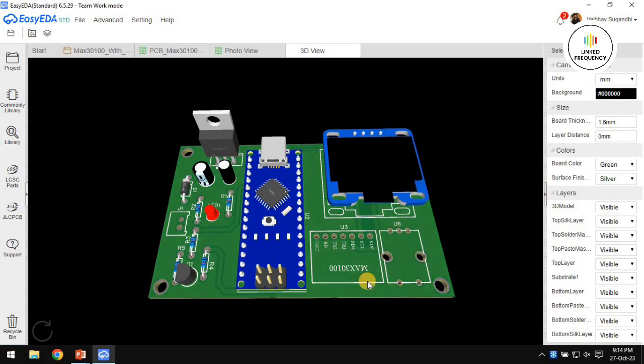We have to manage the placement of the components in such a way that the user should be able to place one finger of the left hand on this MAX sensor, and with the right hand use this rotary encoder to operate this screen as per the requirement. You have to think at a user interface or user experience level while you are designing the components or the PCB, which includes the user interface. That's why this particular part is very essential to understand.